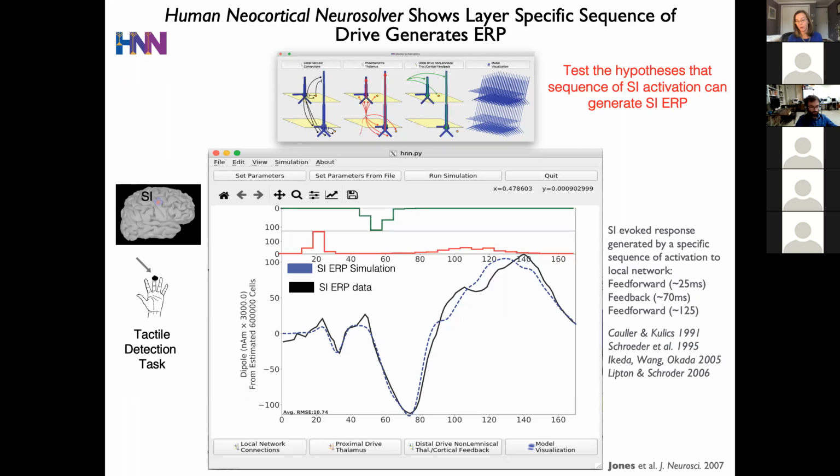Another very good question that I forgot to touch on. We do have some parameter optimization, but right now it's only for ERPs. The way that it works is you first get a good representation of your signal by defining the number of evoked inputs that you want. You start with our tutorials.